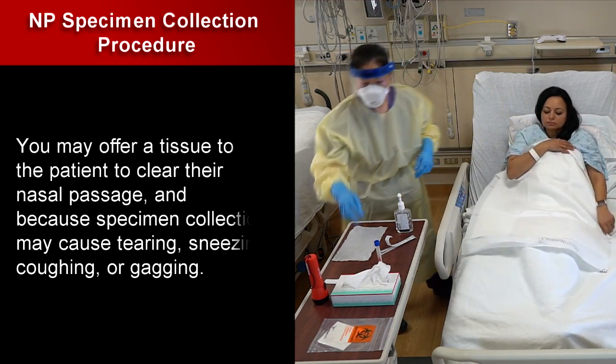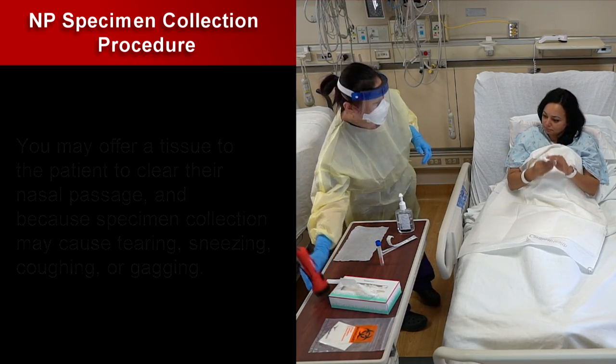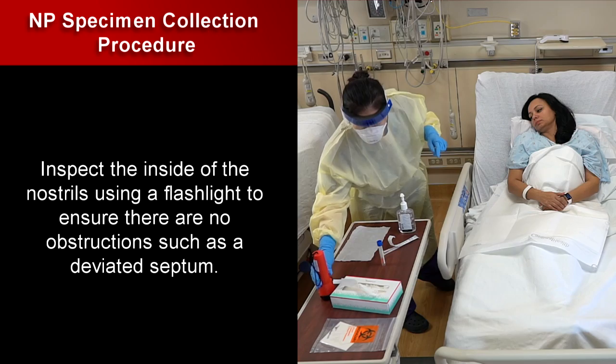You may offer a tissue to the patient to clear their nasal passage, and because specimen collection may cause tearing, sneezing, coughing, or gagging, inspect the inside of the nostrils using a flashlight to ensure there are no obstructions, such as a deviated septum.